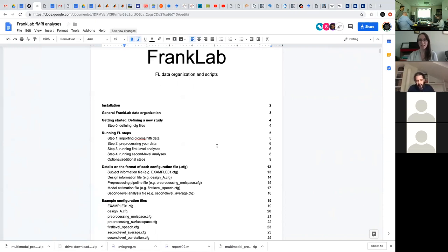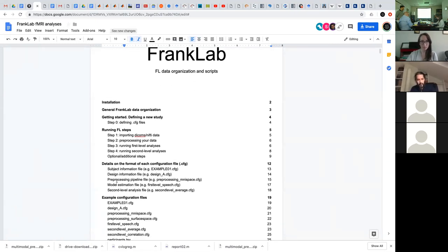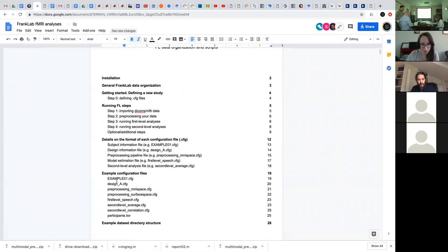So I try to put as much information in there as possible, but there's still a lot of things that are not very well explained. So my plan is just to briefly go over the documentation, just to explain what the second level analysis actually does and how it is organized, and then if you want, we can just jump ahead with your questions and your examples, and we can go over those in a little bit more detail to make sure that everything is working as you would expect, and any questions that you might have are all answered. Does it make sense? Sounds good?